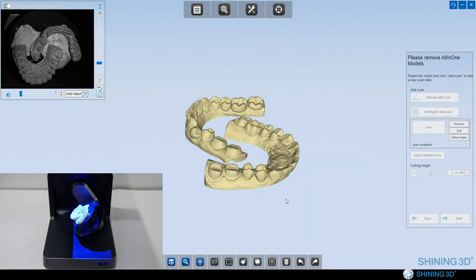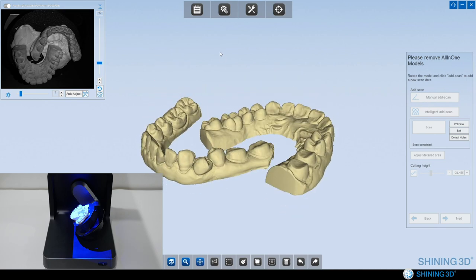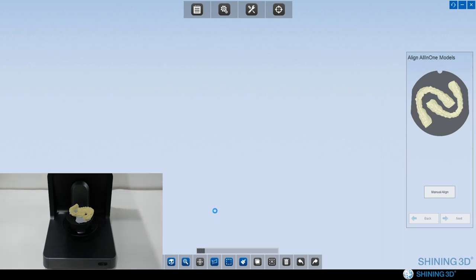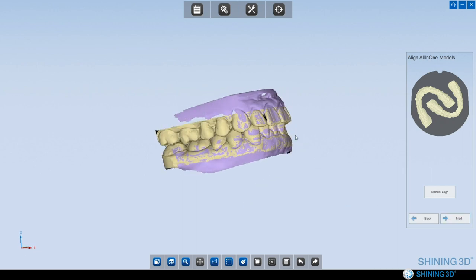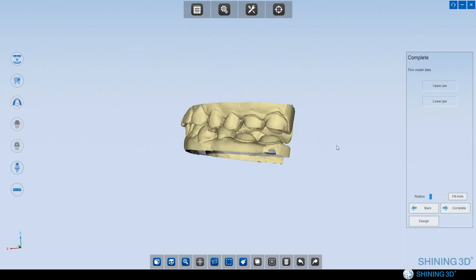Okay, because I have activated the option AI scan, if there is some area not clear around the tooth, software will automatically do a scan. Finish. Then here, software will automatically align the upper and the lower. Next, so just two steps, we get the upper and lower, finish the whole workflow.